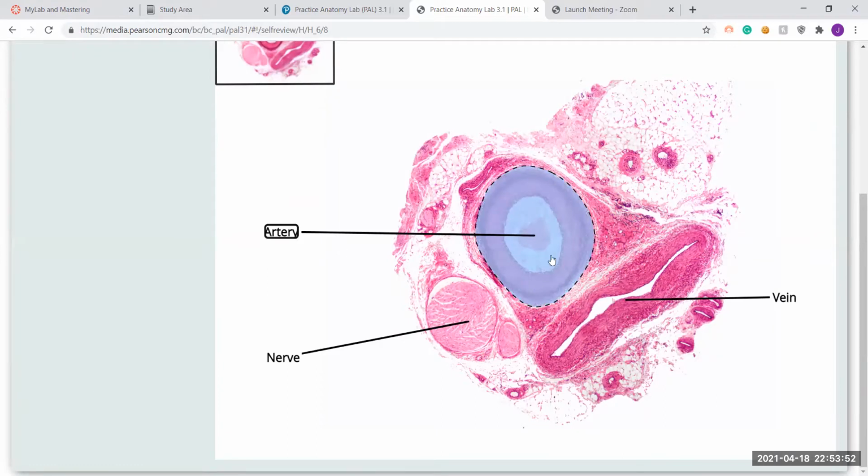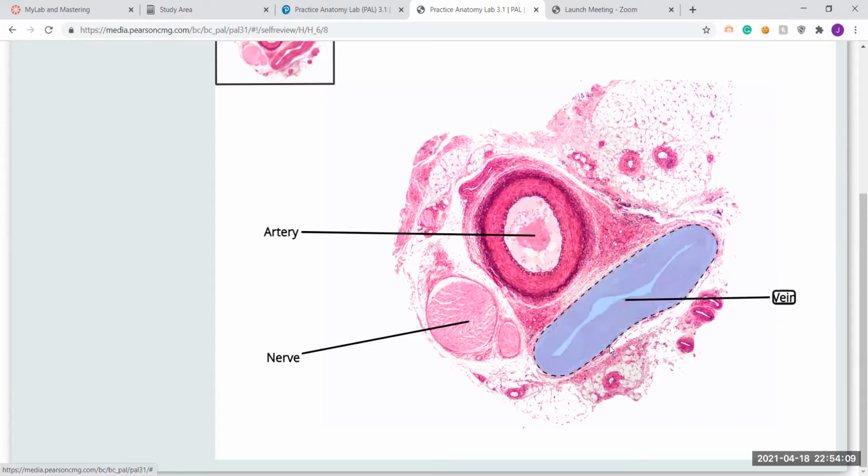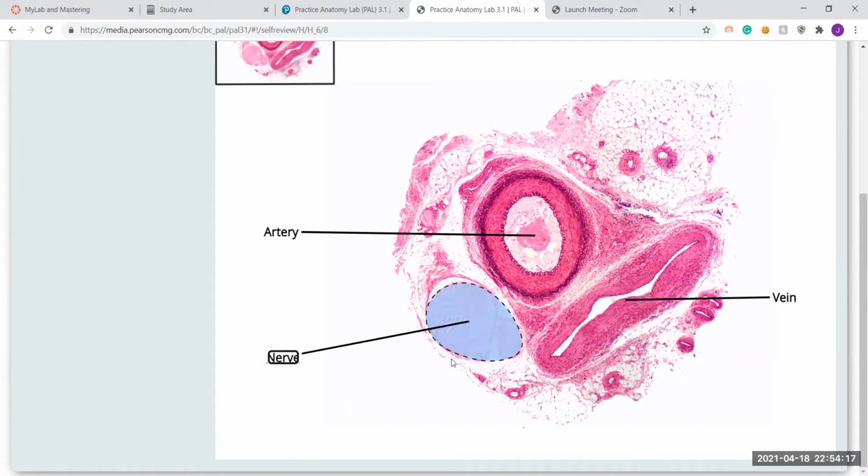Arteries are open because artery walls are thick and they have a lot of collagen fibers, and they are connected to the left side of your heart, which pumps with high force, and that's why they are always open. They have pressure, whereas veins have no pressure. That's why when you cut, veins are collapsed and they have fewer collagen fibers and other stuff. And each artery and vein is also supplied by some nerves. So you can see the nerve section.